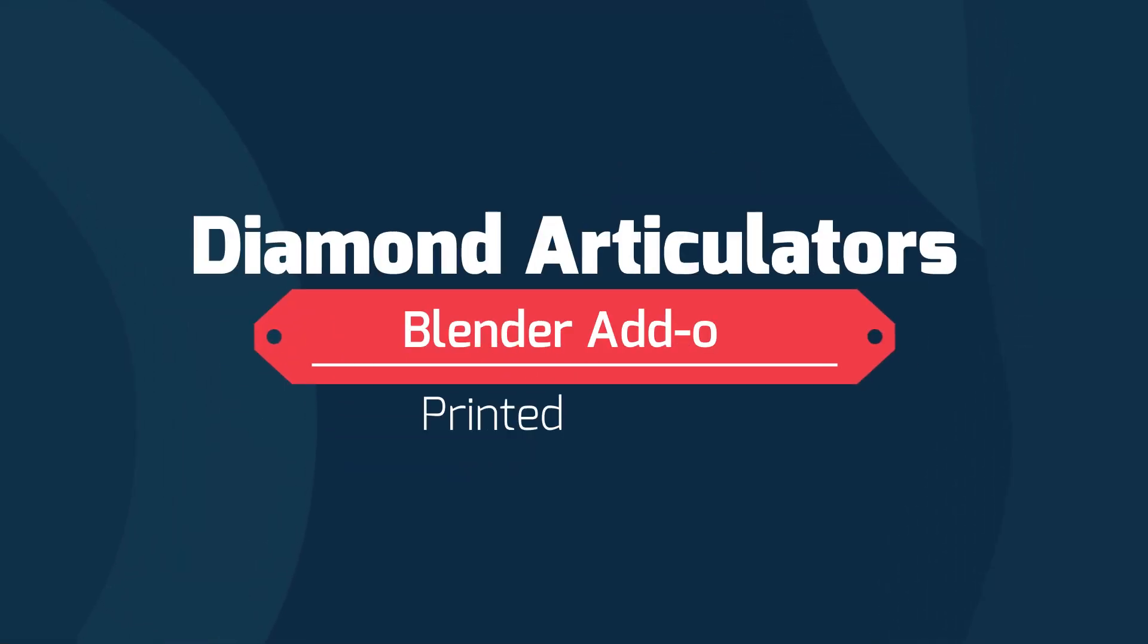Hello, this is Scott with Diamond Articulators. This video is going to be on the Blender add-on. Blender is a free CAD software.